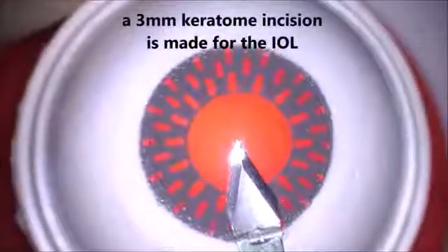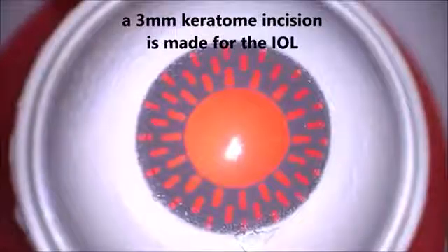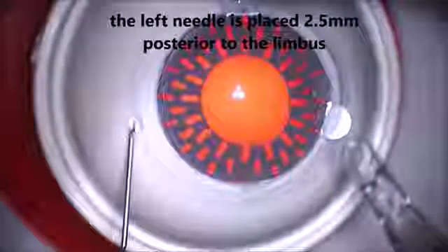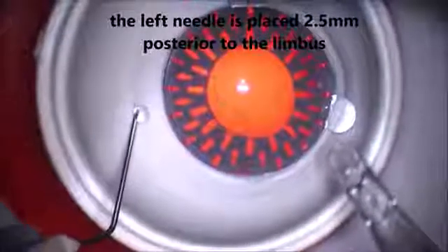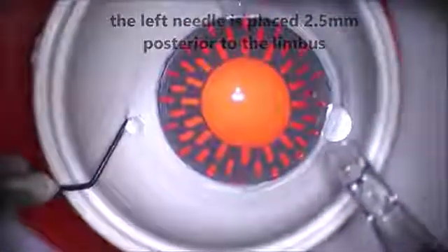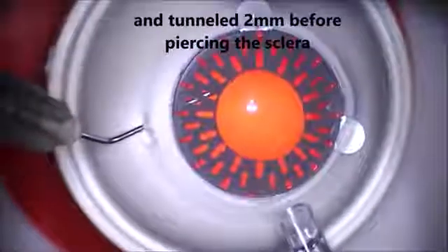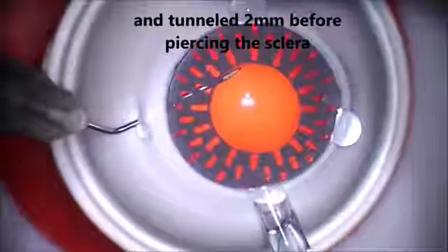A three millimeter keratome incision is made for the IOL. Your incisions for the needle technique must be 90 degrees from your main incision — it's very important that your scleral needle placements are 90 degrees from the main incision. The left needle is placed two and a half millimeters posterior to the limbus, tunneled two millimeters, and then dives into the eye. This left side needle is bent nine millimeters from the tip so that when released into the eye, the needle-haptic-IOL complex doesn't move around too much in the vitreous space.